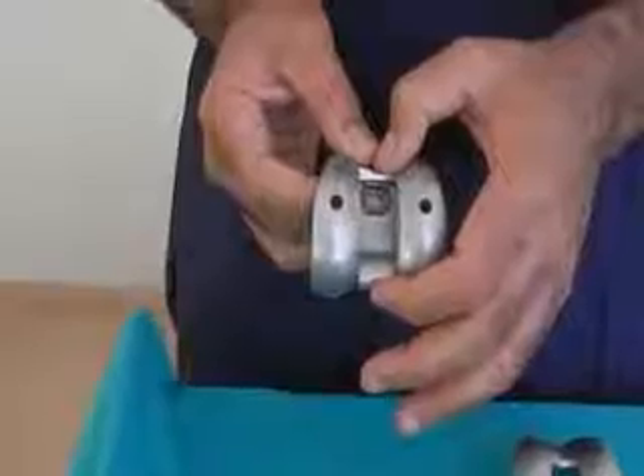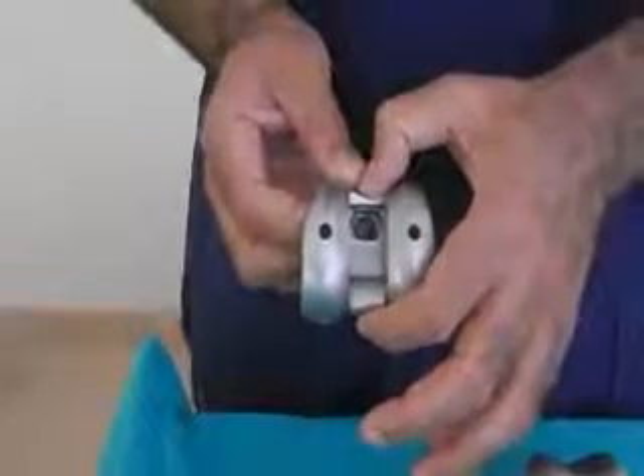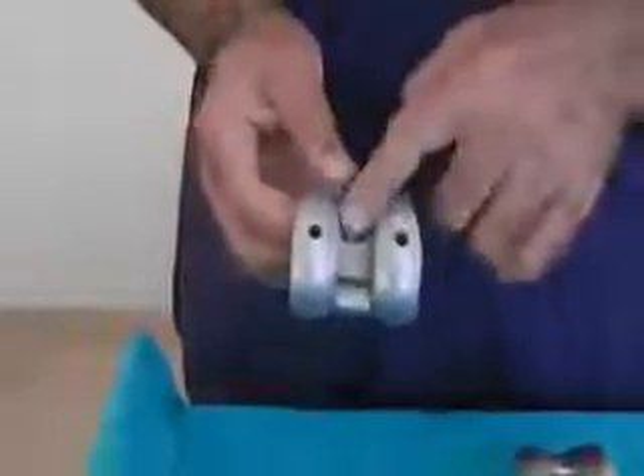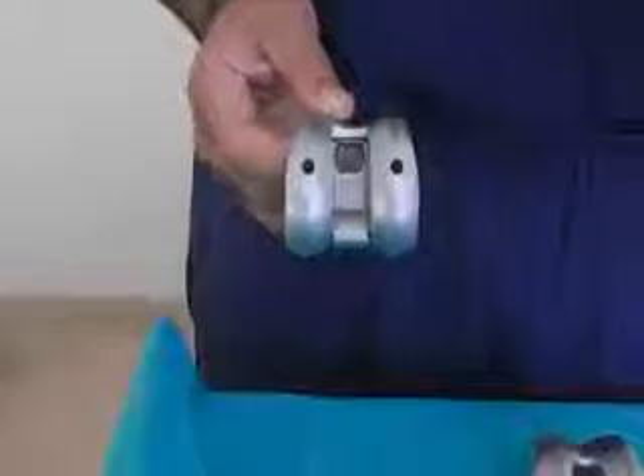Let's start with the DePuy PFC Sigma, which has been used in our market for the last 25 years. Excellent performance but with a few issues. Looking at the posterior stabilized design, the box is very high and the box ratio is too long. The reason is that you can put a stem in the femur, and that is why the box is longer or taller compared to other knee designs. This leads to a higher incidence of patellar clunk and painful crepitus, as published in many papers.